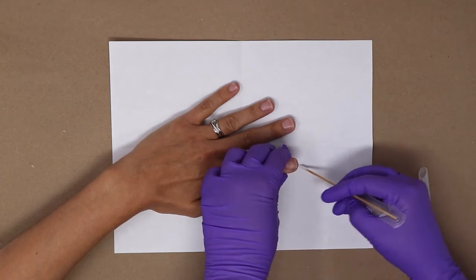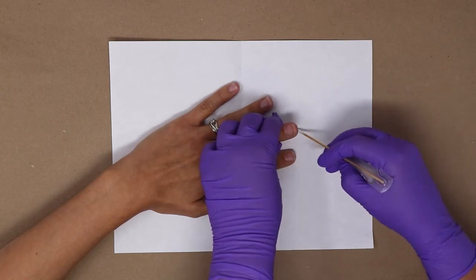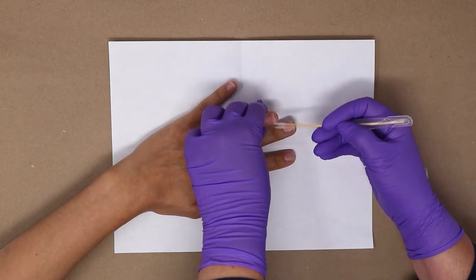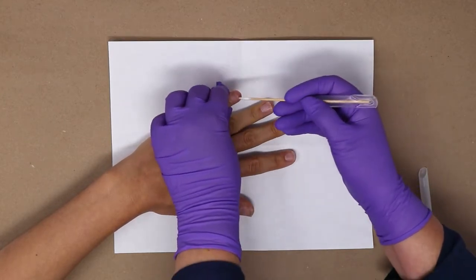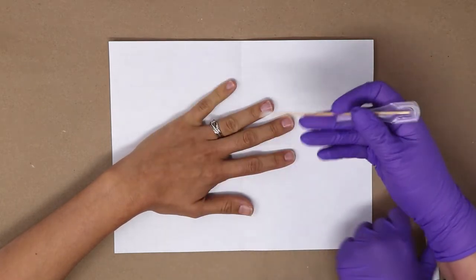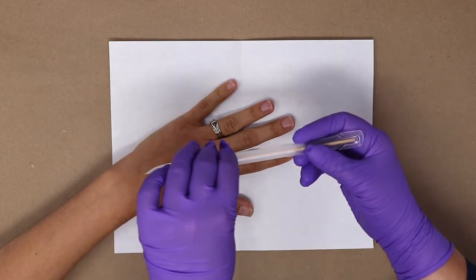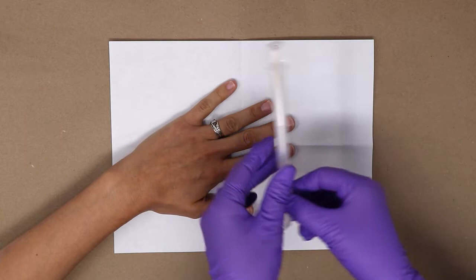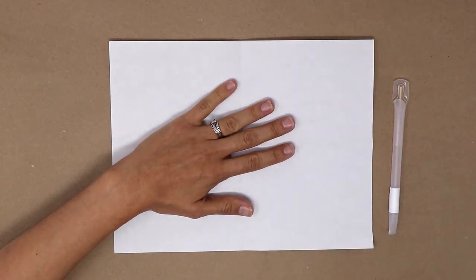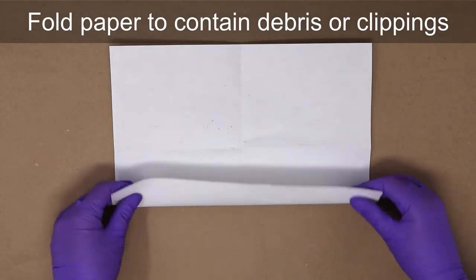The collection paper is used to collect and enclose any debris that is loosened during this process, and care should be taken to avoid disturbing the loose debris or transferring it to the fingers. Alternatively, the fingernails can be clipped using a sterile pair of scissors, and a separate pair should be used for each hand. The mini swab is placed back into the collection tube and retained. The paper is then folded to contain the loose debris or fingernail clippings.